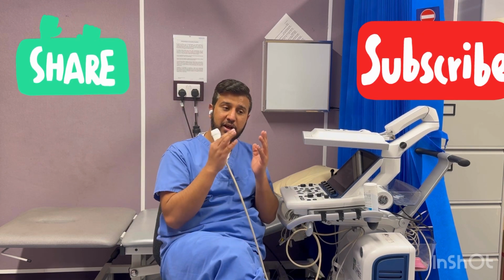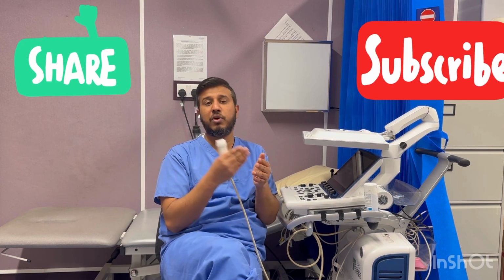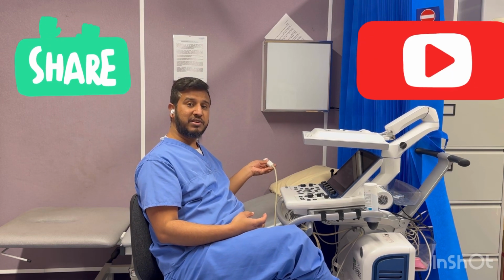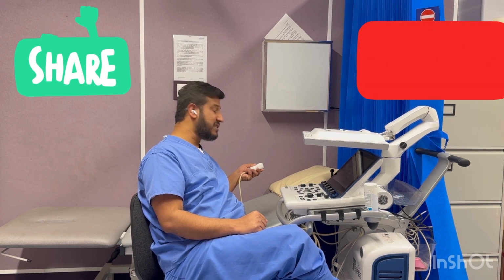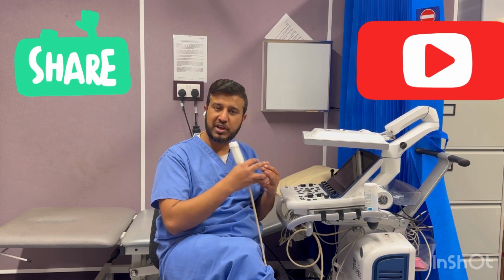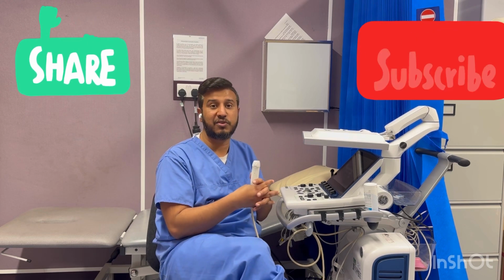In parasternal long axis, you can get two more views. One is the RV inflow view, and the other one is the RV outflow view. For the RV inflow view, you just need to take your tail upwards and you will see the RV inflow view. And once you take your probe downwards like this, you will see your RV outflow view. So it's a very easy one. I'll show you the views later on. I want to go quickly through the imaging because I know you will be practicing in your own echo lab and your seniors will be with you, so you can learn it from there.